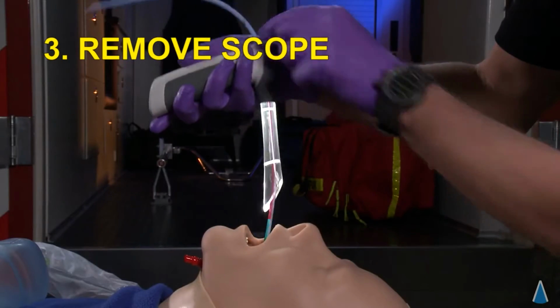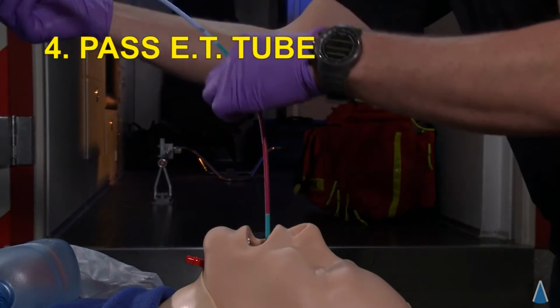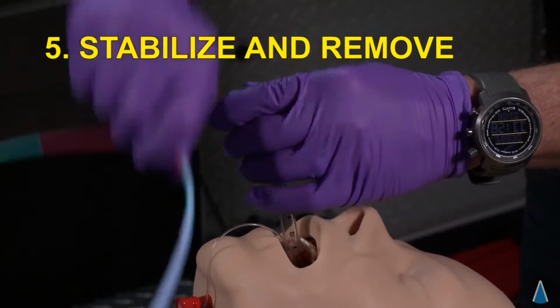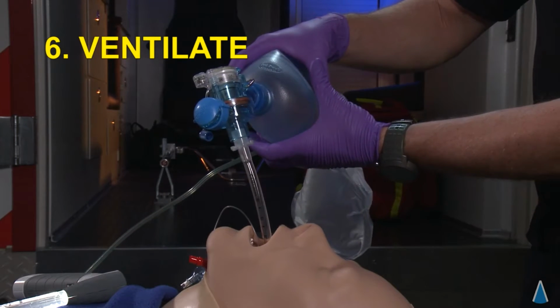Remove the V-scope while leaving the bougie in place. Pass the endotracheal tube over the bougie into the trachea. While keeping the endotracheal tube stabilized, remove the bougie. Ventilate and follow your protocols to verify tube placement accordingly.